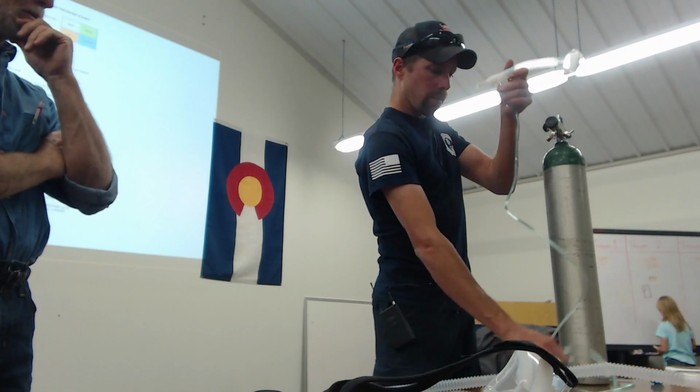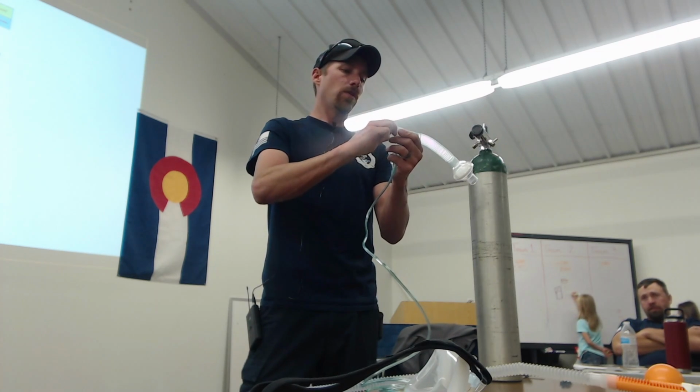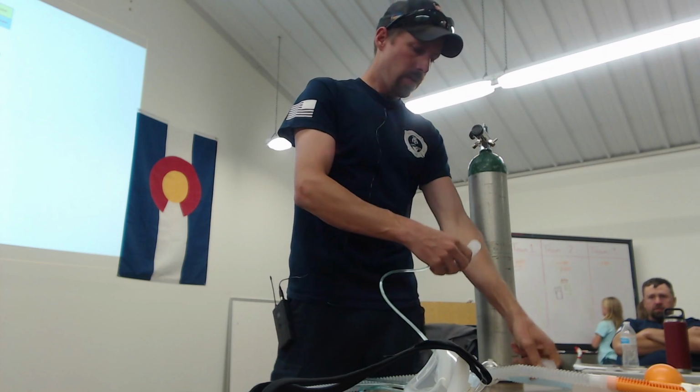So just a quick review on the nebs. Again, it's an aerosolizing procedure as well. So if you're doing a regular neb treatment, make sure that you've got your HEPA filter on there. If you're doing it in this manner, if you're hooking it to the mask, you can do the same thing. Just make sure that wherever the air is coming out, you've got that HEPA filter on there. Since we're not using that stuff.